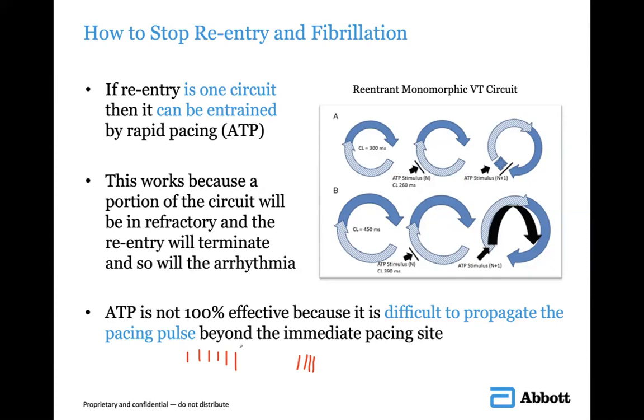Because during the programming, you see burst, maybe they put it 2-3, ramp, maybe 2. Yeah, exactly. So you have different options, and we can go into that in more detail later. But the real premise is that with ATP, there's more complexity if you'd like to be more aggressive with your programming. And this is within defibrillators, obviously. You wouldn't do that with surface pacing. I've never surface paced like that. But yes, there are different ways to customize your ATP.